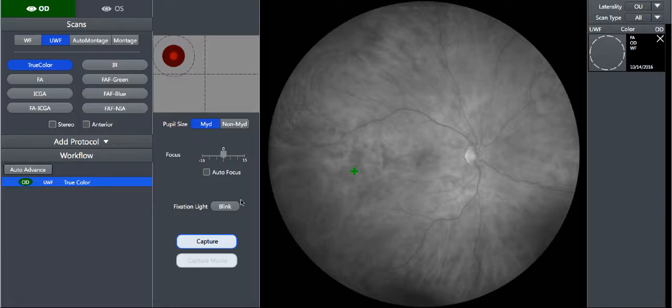We have a left to right columnar workflow, as you might expect. Here, the user selects the scan and the field of view to be used. Down here, we have a workflow panel. This shows the laterality, scan type, and field of view that I've selected up top. And were I to go through a full exam, different scan types would show up as additional rows, so I have a readily accessible record of what was captured.